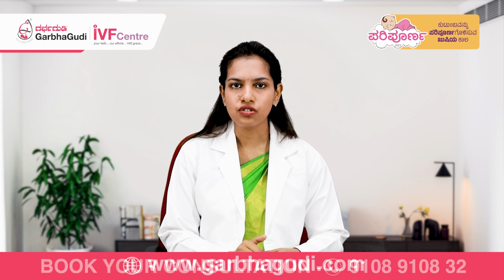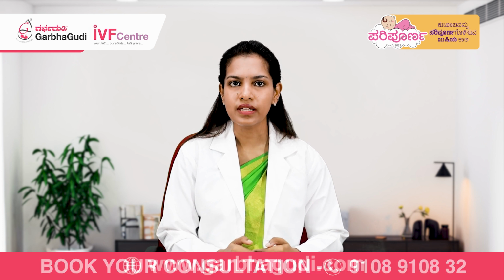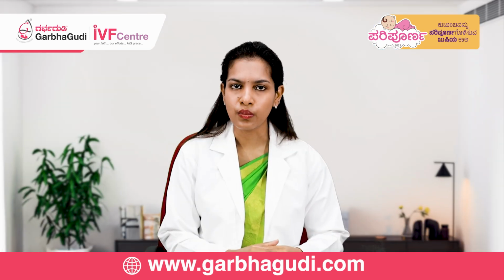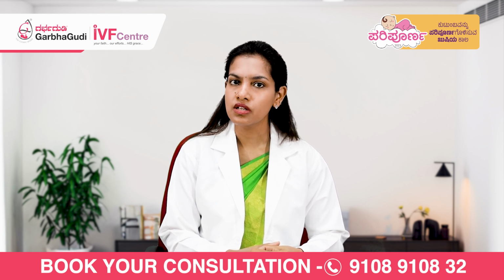So the advantage of this procedure is that it is both diagnostic and therapeutic at the same sitting, meaning we can see and treat. Another question that we get asked frequently is if all female partners who are having fertility issues need to undergo hysteroscopy. The answer is a no.